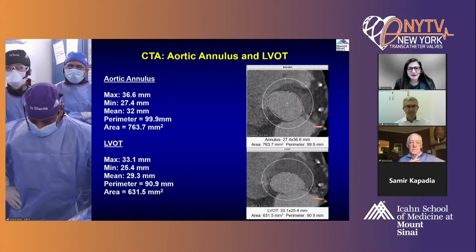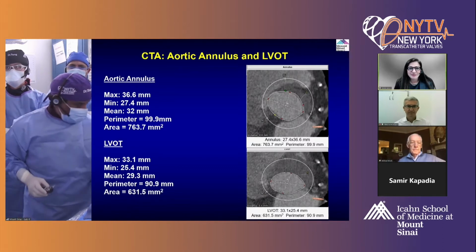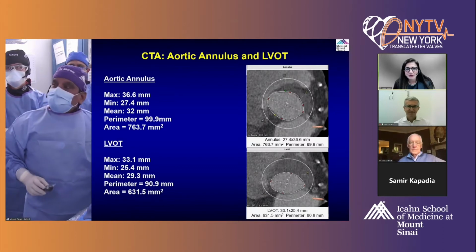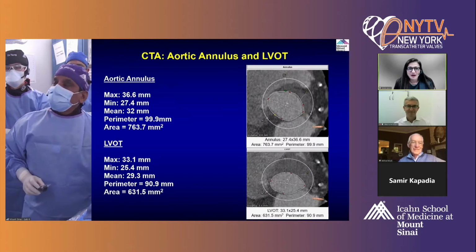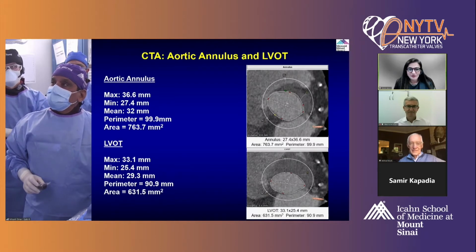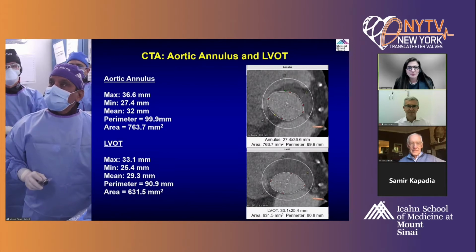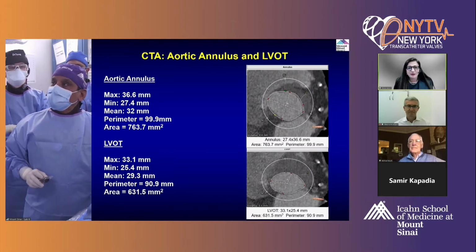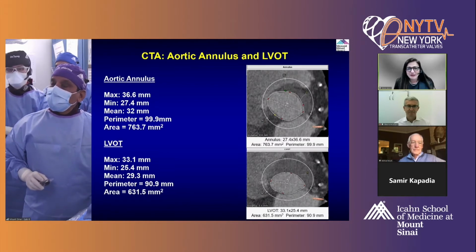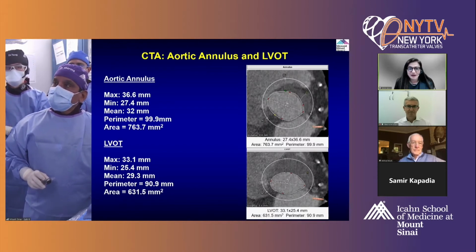No, those are excellent explanations. And I think we are learning a lot now. We all got a mass email from Edwards about echo parameters in understanding hemodynamics versus what's happening. I think we're going to have a very good discussion around this, but you are absolutely correct that this is most likely a different view. This is definitely a congenital bicuspid valve. And now you're going to tell us the CT measurements, Dr. Sharma. We're back to you.